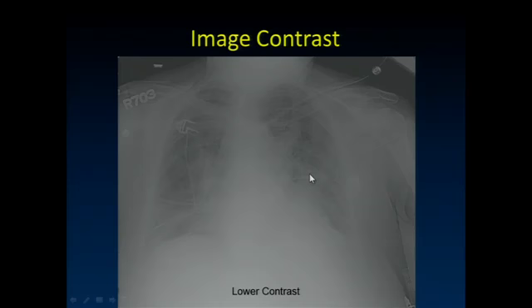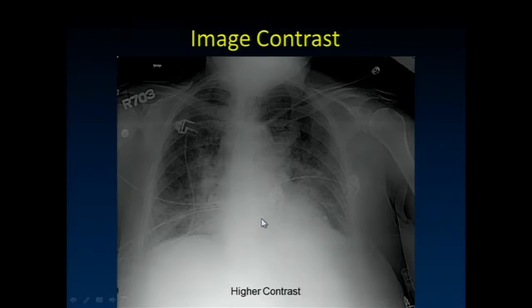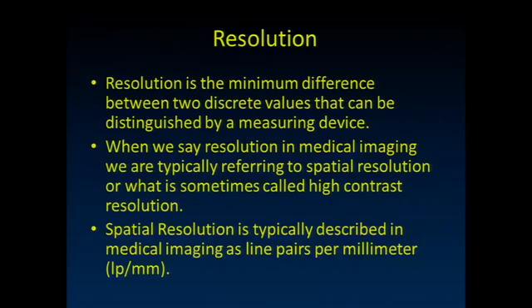But conceptually, we all have a really good idea of what a low contrast versus a high contrast image is. And one of the nice things is, at the PACS, we can adjust the contrast as well. We can't adjust it to the same degree that the tech could by changing that constant K. Remember, that's something that the tech did before they sent the image to you. If you ever have an image and you can't see a particular area well, ask your tech to go back and reprocess it, and they'll adjust the K. Let them know the part of the image that you want to try to see the best, and they'll choose a K that gives you better contrast in that region, okay? The only downside is the image might get quite noisy in that region.